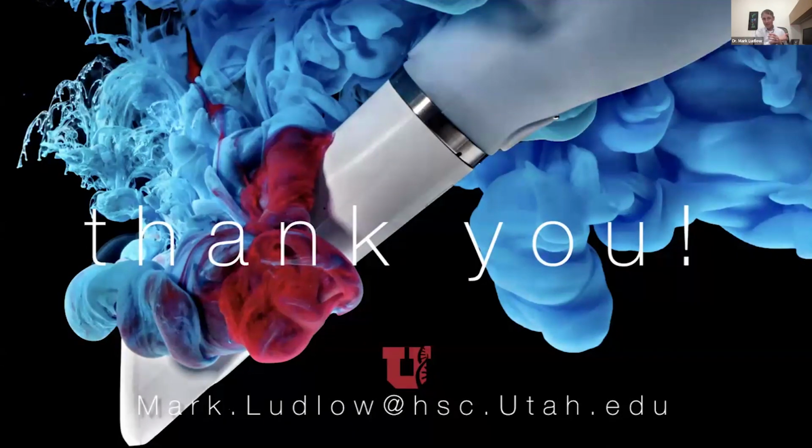But I had a case last week where I was cutting off these really, really old feather-prepped margins that were literally down on the bone. And guess what? That one, I took a PVS impression just because they were so far down there that the beam of light, I could have probably got 1.5 out of the 3 crowns in that quadrant, but I would have struggled with the other ones. And so that's why, again, I just switched materials and moved to the PVS. So use what's best for the case.